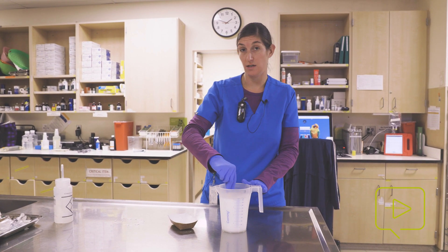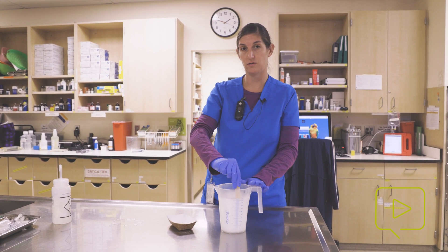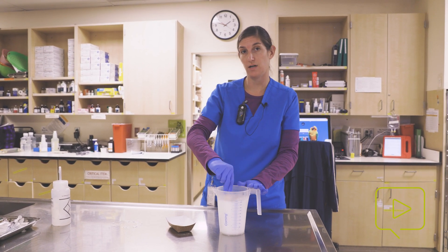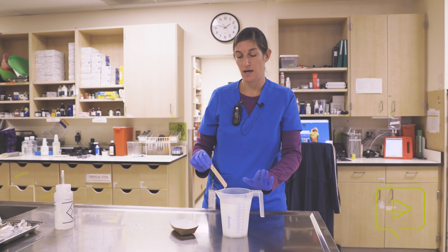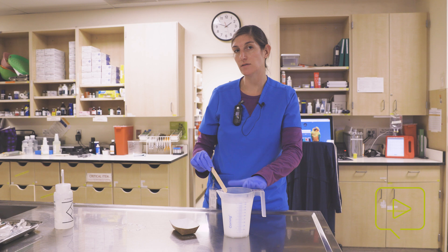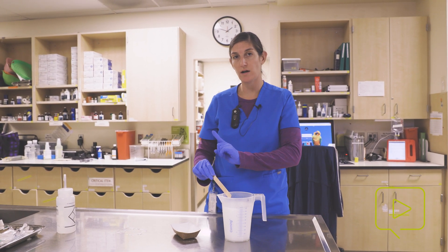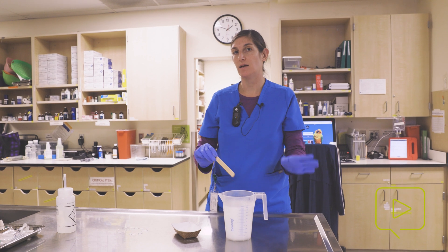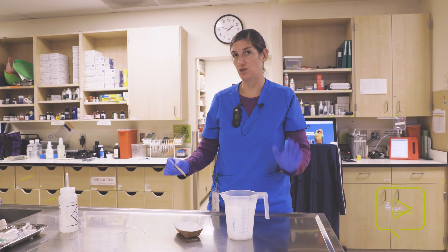This is a stock solution, so it needs to be diluted. In order to create a 100 milligram per liter solution, I'm going to need to add 10 mils of this stock solution to one liter of aquarium water. You can do the math based on how many liters of aquarium water you have in your anesthetic induction chamber.